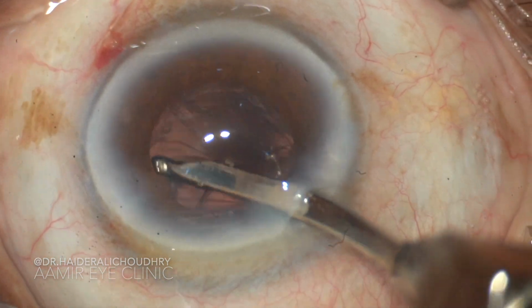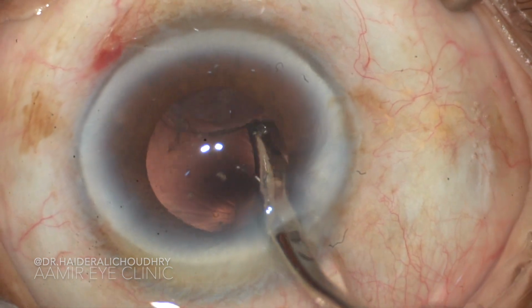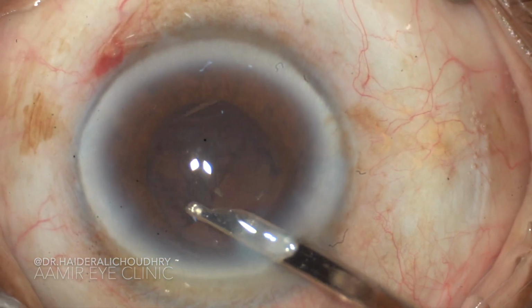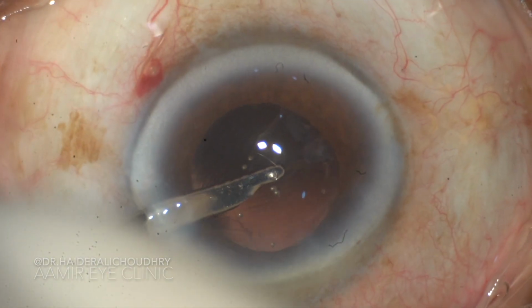Then we switch to the main incision and release a small nuclear fragment that is lodged in the main incision and continue aspirating the rest of the cortical matter.